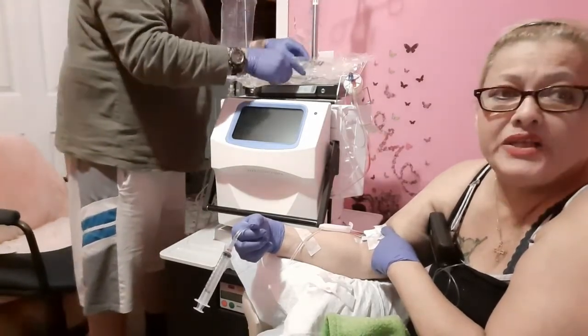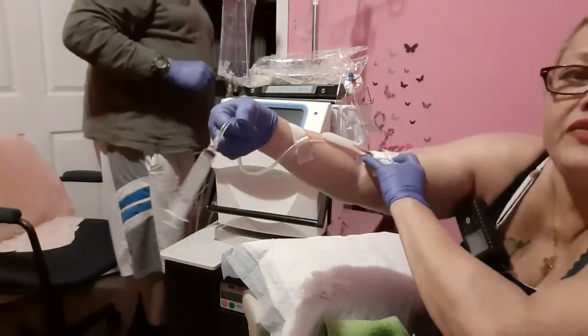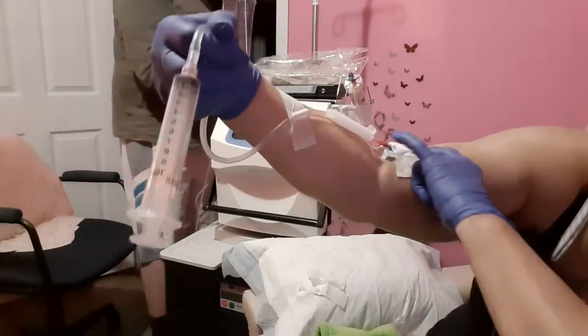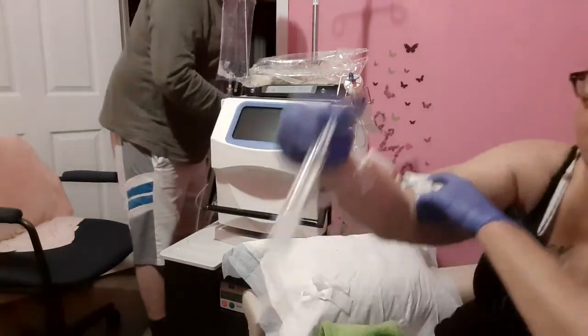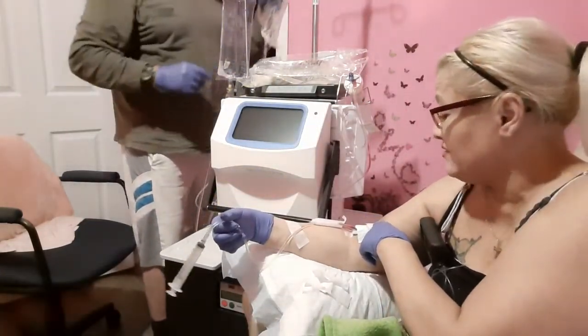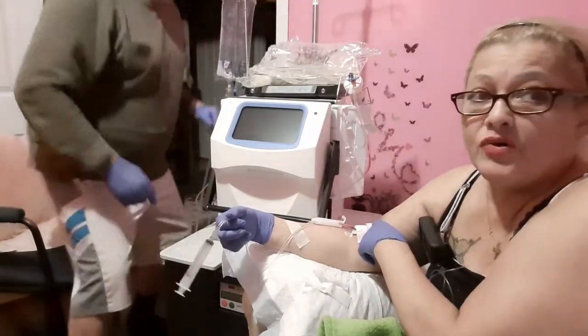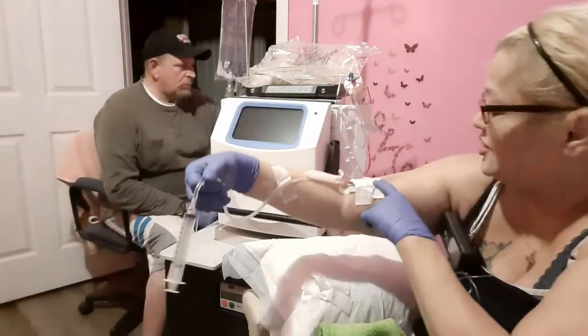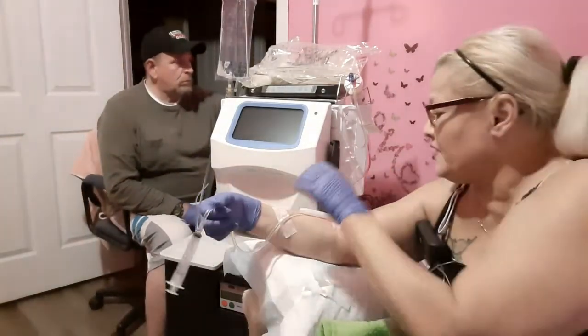And all it is, is a piece of tape underneath the line, and it's a V. Just a V, and it holds the needle underneath. So you can pull, it won't come out. I mean, not hard. All right, so it's been about a minute, so I'm good there.